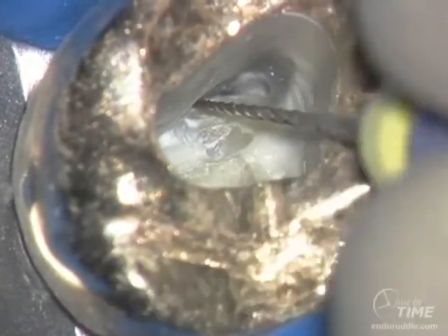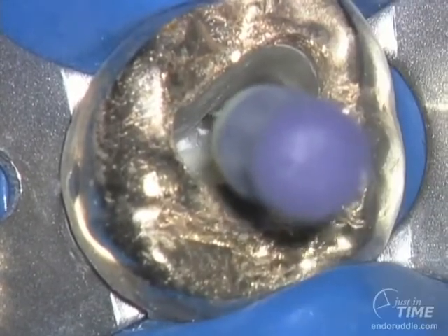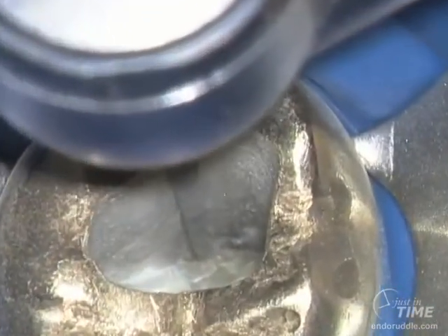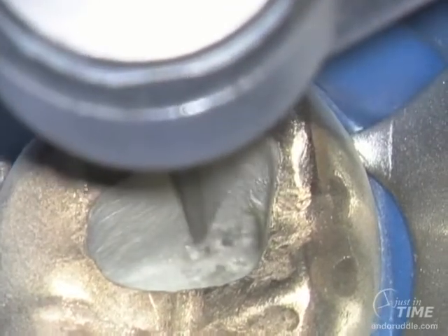Rather than try to negotiate the full length of the canal, it's important to stop and re-evaluate: do I have good access? The answer is we could benefit from using a surgical length diamond and taking the entire mesial wall back at the expense of the mesial marginal ridge. This will tend to upright our hand files.